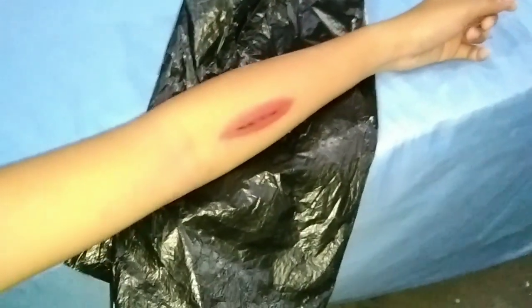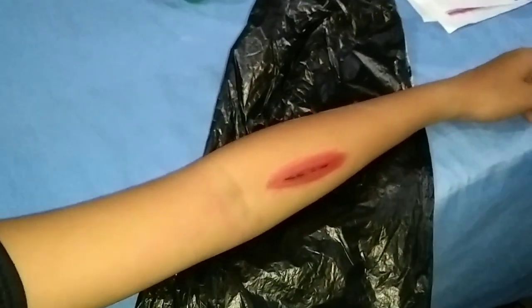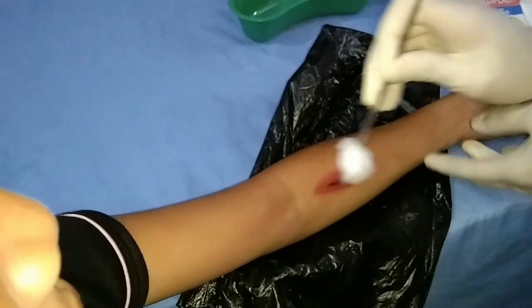After cleansing, apply a sterile gauze sponge to the wound. Okay, and then we need to dry it muna. And discard.